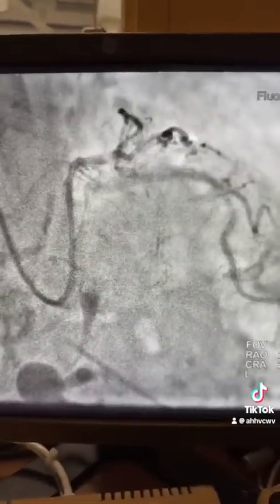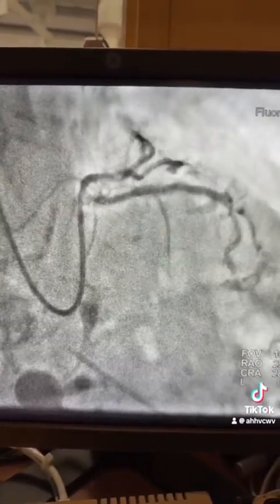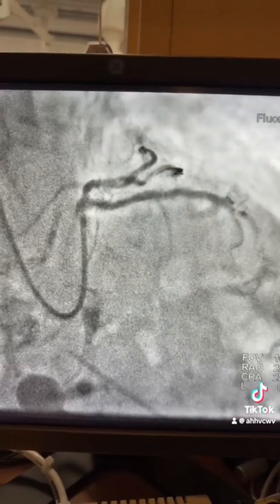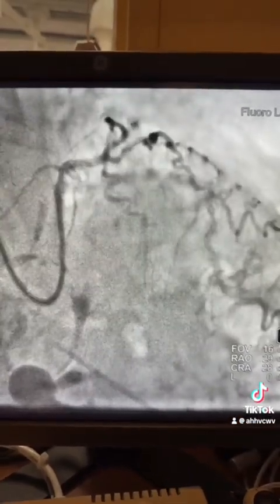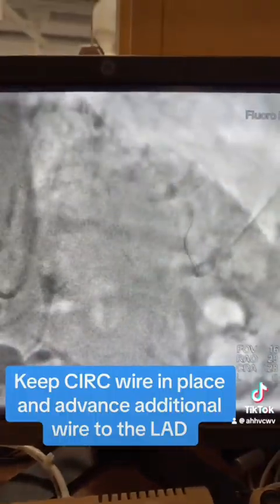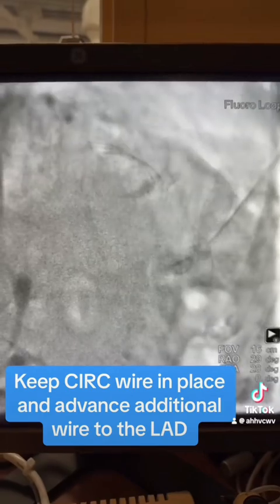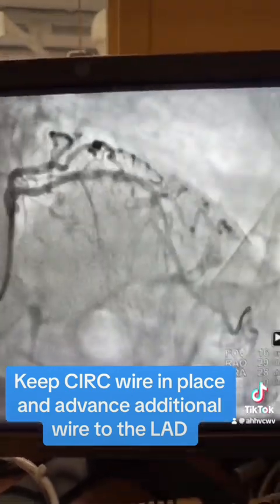Advance another wire — a Runthrough or Floppy wire — toward the LAD, as you can see. The angle here is a little bit difficult, so keep the wire in the circumflex, pull the guide a little bit or redirect it toward the LAD. And here you see the wire going through the LAD — that's the lesion.